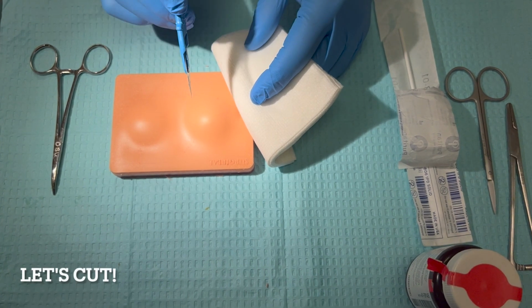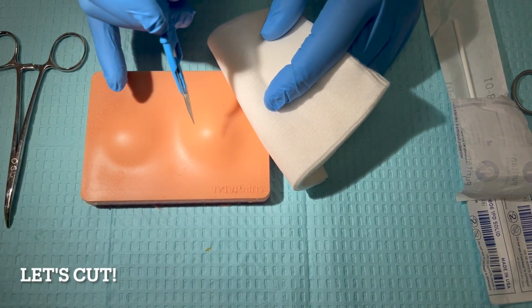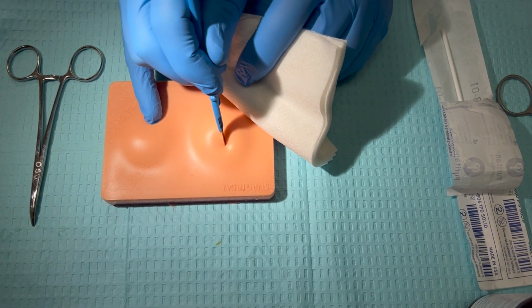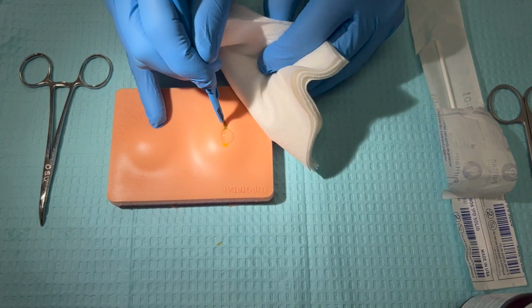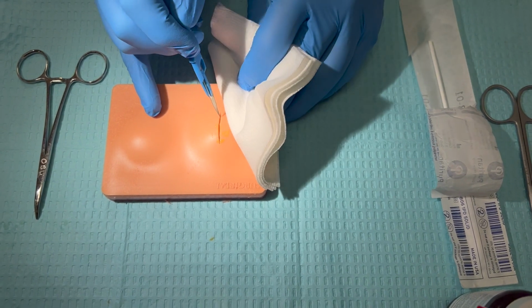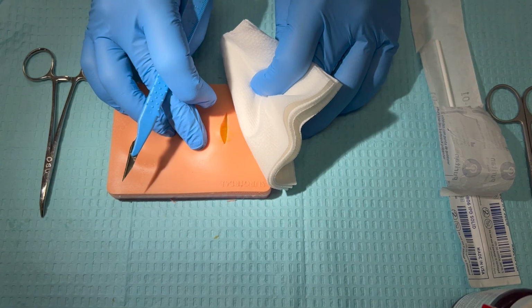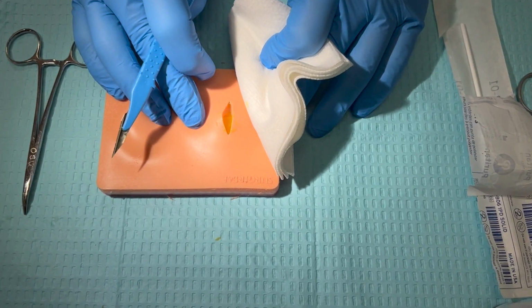Now we're ready to make our incision. I'm going to make the incision distal to proximal with reference to myself. And again, we want to make sure that it is into the area and that we are coming far enough along the entirety of that abscess, being prepared, making sure that we are comfortable with the length as well as how well we're able to kind of gape that area out.